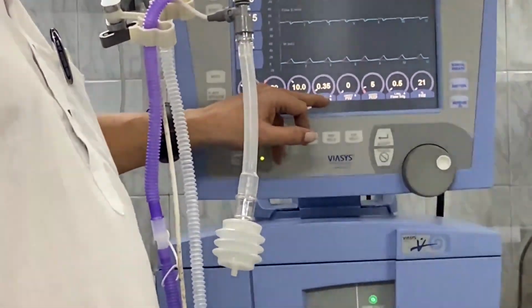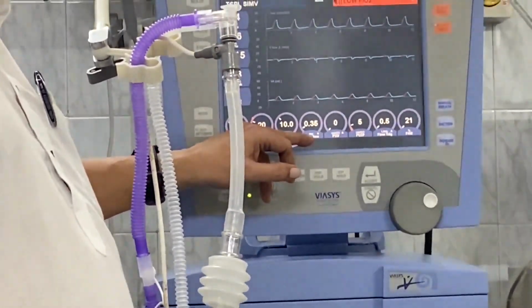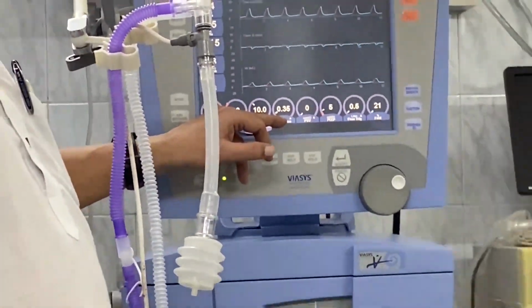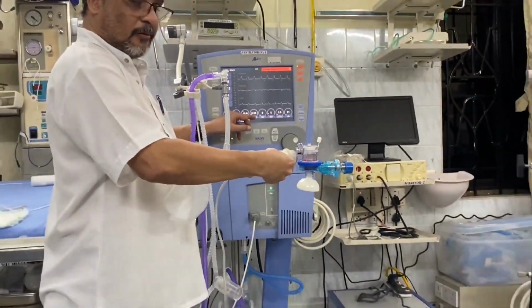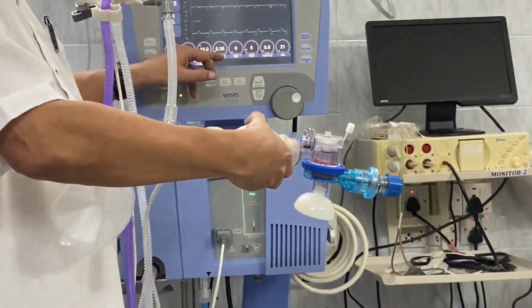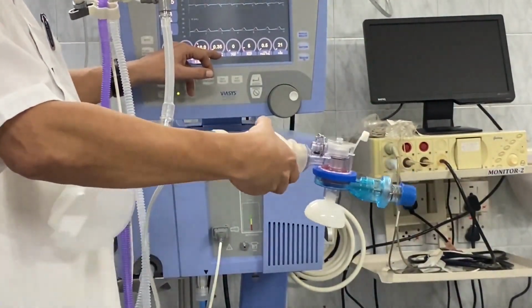In adults, the rate is lower, so the inspiratory time gets prolonged to 0.75 to 1.5 seconds, whereas in children it is 0.35 seconds. So this is the time called inspiratory time. Once I release the bag, the baby goes into expiration. Once I press the bag and keep it pressed, this is the inspiratory time, and then the expiratory time.